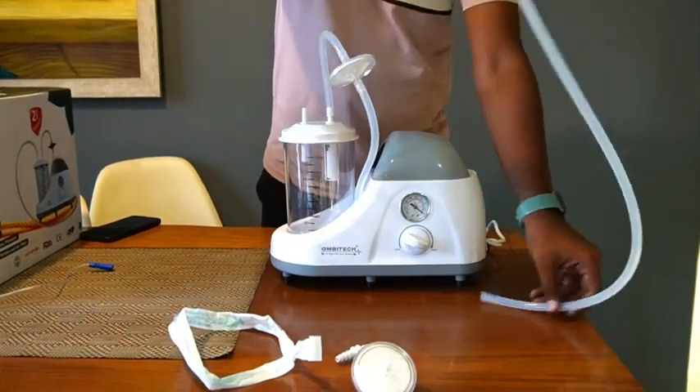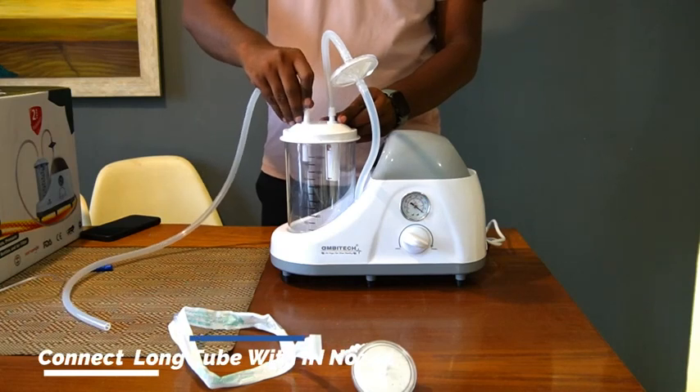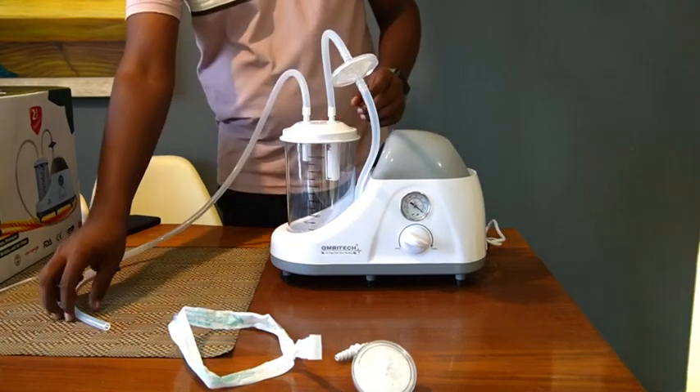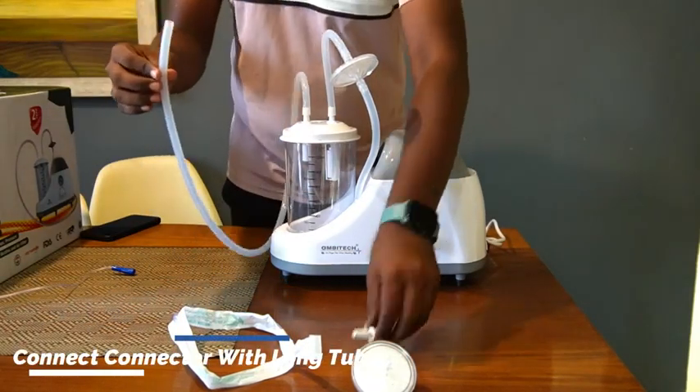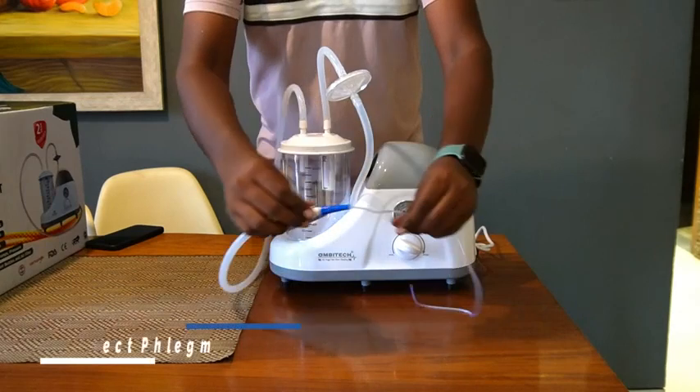Then, insert the long silicone tube of length greater than 1.3 meters to the liquid inlet or the in nozzle of the reservoir. Connect the other end of the long silicone tube to one end of the connector. Then, connect the other end of the connector to the phlegm tube.